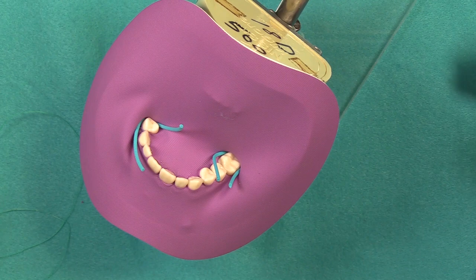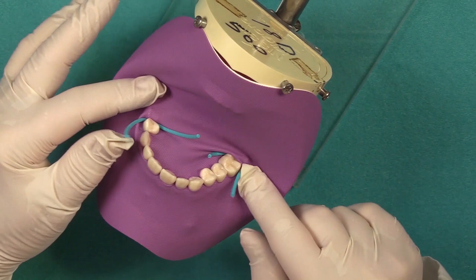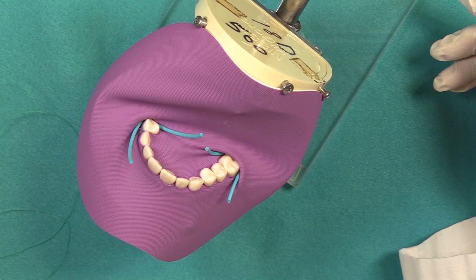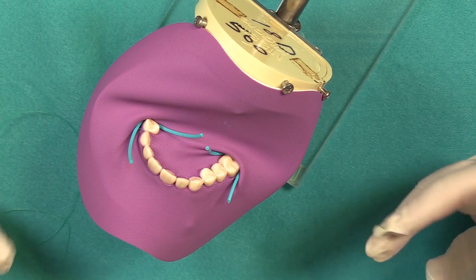The more posteriorly you go you'll find that you really need someone to hold the dam down. As you can see I was struggling a little bit myself as I got back here in an effort to place my wedged cord. But it really goes pretty quickly if you do have someone to help you. I normally apply dam by myself most of the time and so therefore, you know, these are issues that I kind of work with.